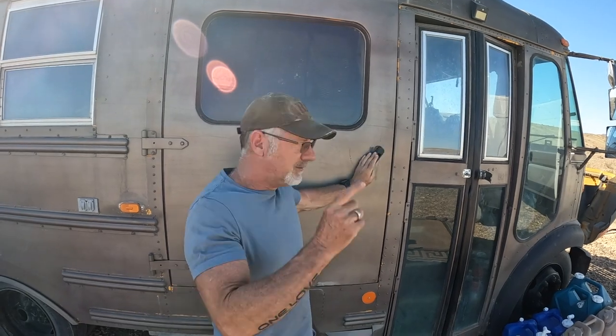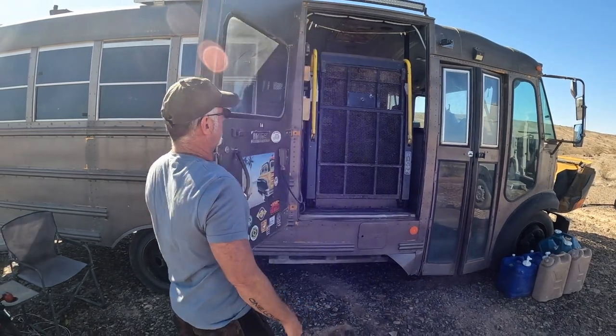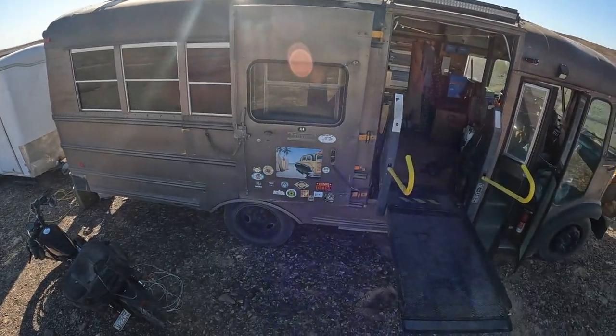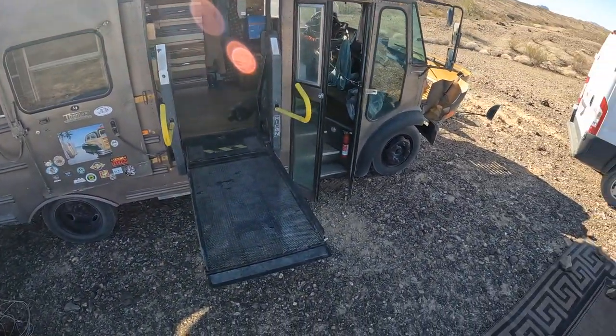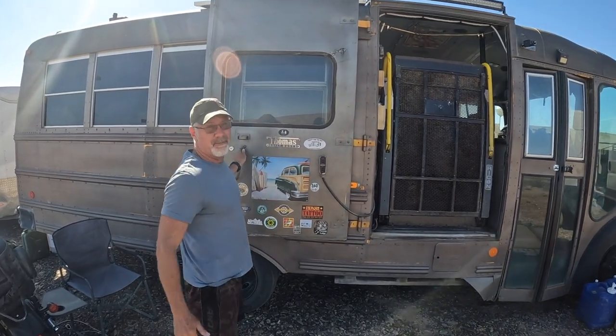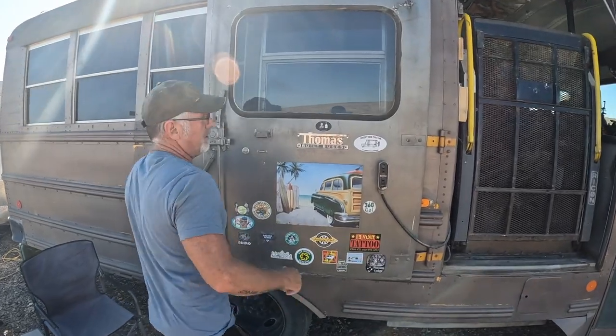You are about to see the most exciting video on how to service a Ricon wheelchair lift that you're ever going to see on the internet. How do I know this? Because I looked for them and I saw the videos that are out there, and I couldn't find this. So I'm making a video about it — hopefully you're in my situation and you find this video.